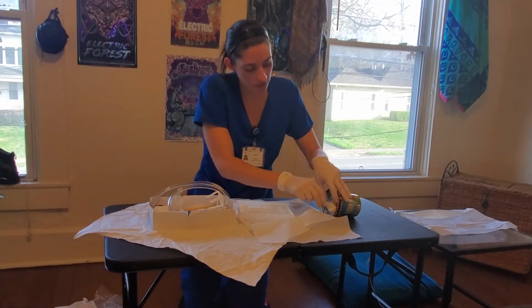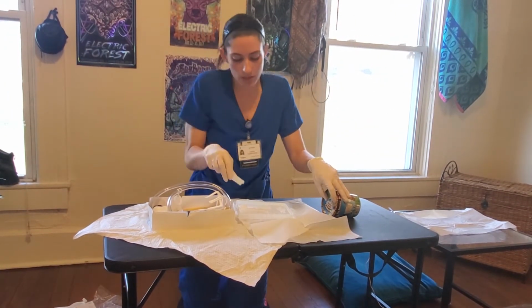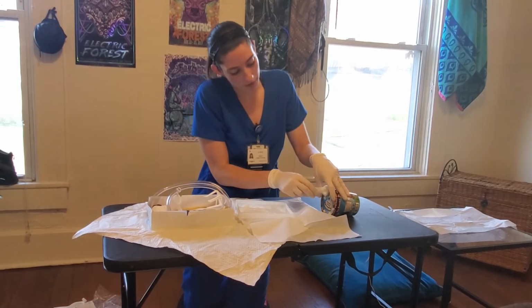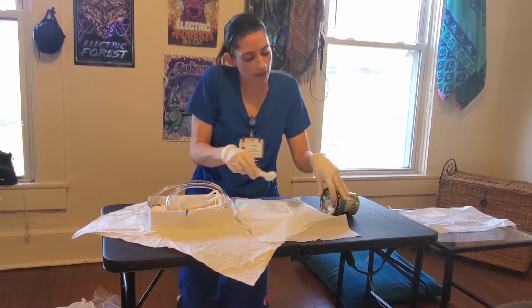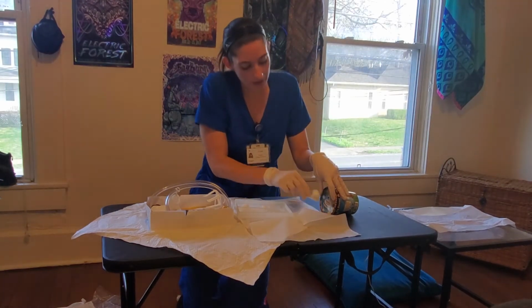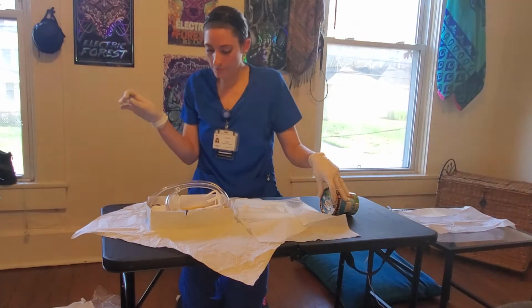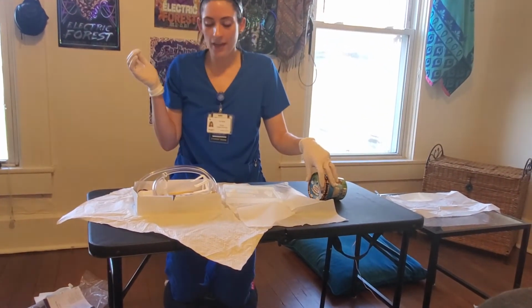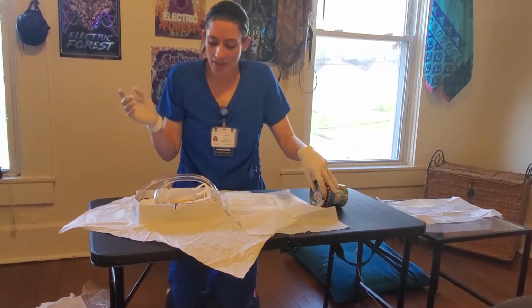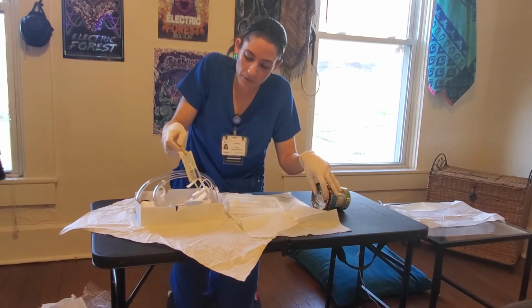Following the same procedure where we clean from the top to the bottom, the farthest side of the labia first. From the top to the bottom, the closest side of the labia. And down the center of the urethra. Okay, so now we can insert the catheter. So I'm going to remove it from the lubricant package.